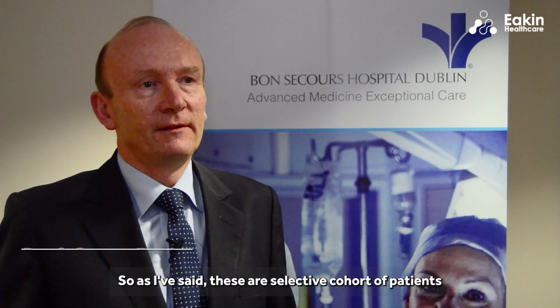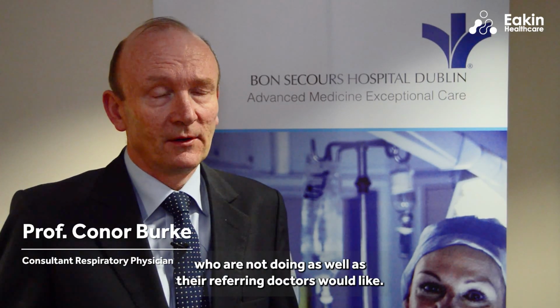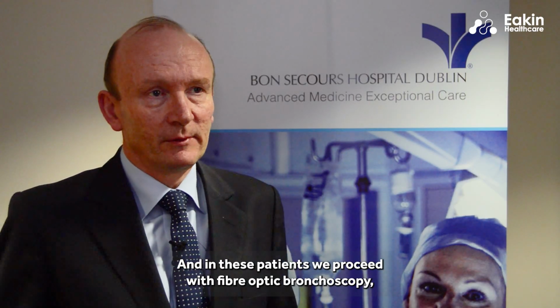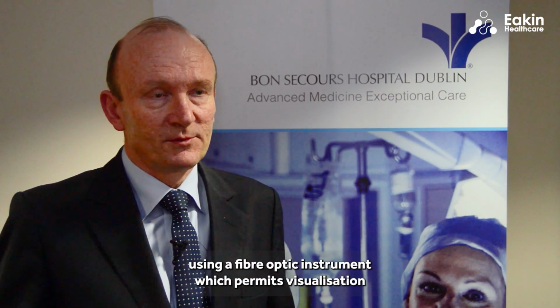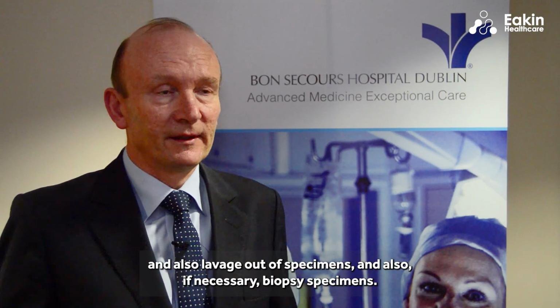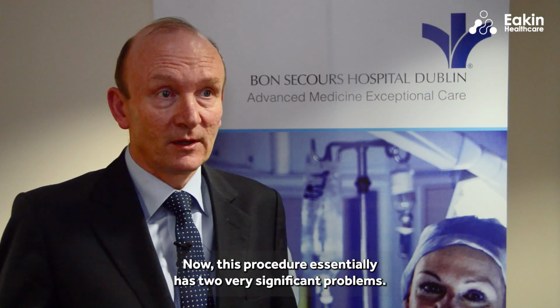Okay, so as I've said, these are a selective cohort of patients with various advanced forms of airway disease who are not doing as well as their referring doctors would like. In these patients, we proceed with fibre optic bronchoscopy, which involves visual inspection of the upper and lower respiratory tract using a fibre optic instrument, which permits visualization and also lavage out of specimens and also, if necessary, biopsy specimens. Now, this procedure essentially has two very significant problems.